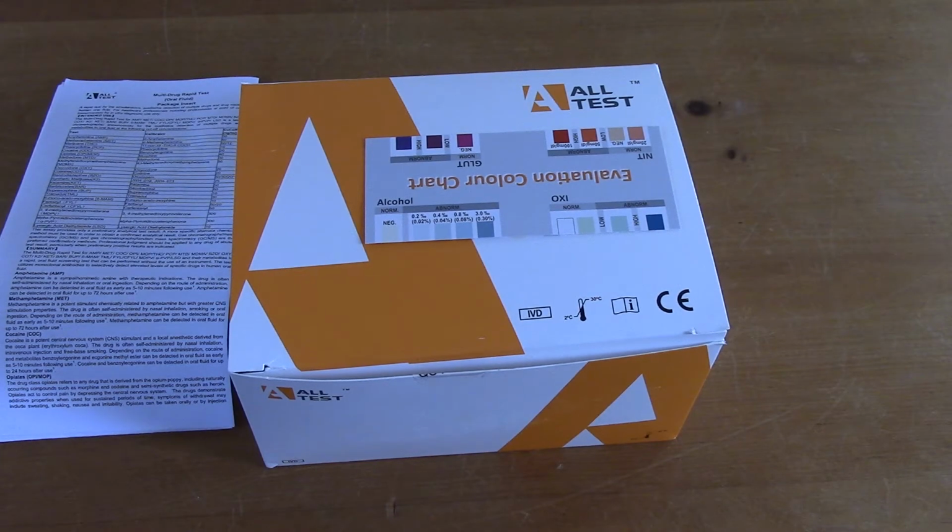It doesn't go down to zero for absolute zero tolerance, although this no pad colour change indicator will give you a zero reading, but you are allowed up to 0.02 because some alcohol is produced naturally in the body from ingestion of sugars through yeast. So 0.02 is the important reading on that to start indicating alcohol of significance as far as any occupational risk.